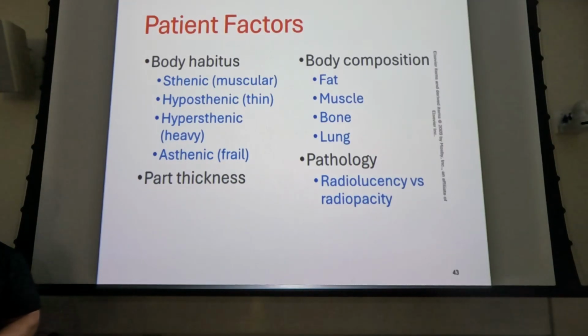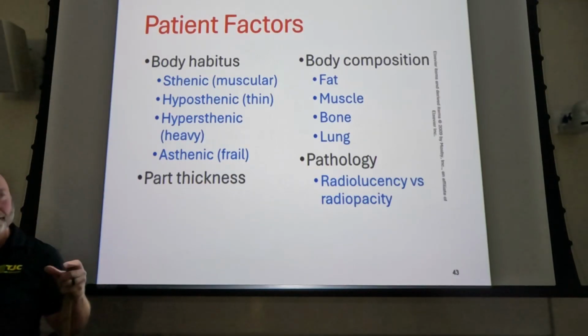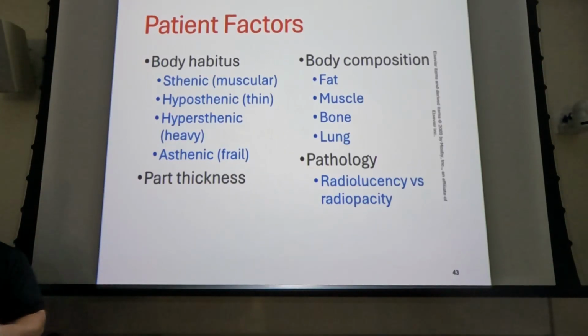Is the pleural effusion going to absorb more x-rays? Yeah, so it's additive, right? As opposed to a pneumothorax. Now the lung is collapsed and all you've got is air and you don't have any of those lung markings at all. Is that additive or destructive? Destructive. Emphysema. Hyperinflation of the alveolar sac so that you've displaced some of that lung tissue and your alveolar sacs hold more air than what they should. Additive, destructive. Destructive.